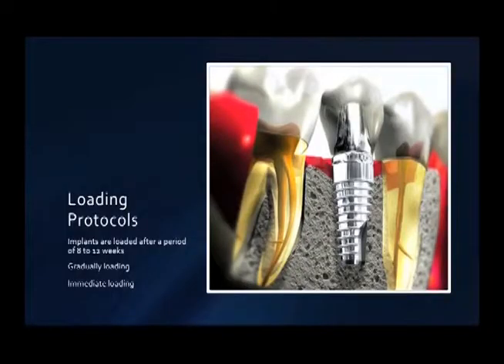So implants are able to be loaded anywhere between 8 and 12 weeks. And this is what I say, and perhaps even longer if you have a medically compromised patient, you want to wait a little bit further. There is loading at that 8 to 12 week mark. There is gradual loading and immediate loading.